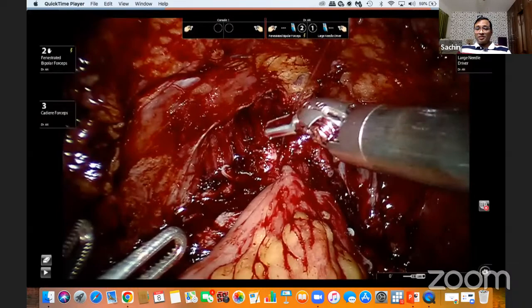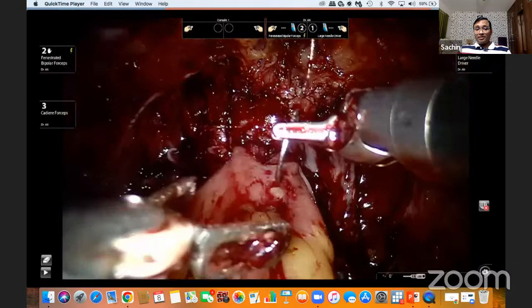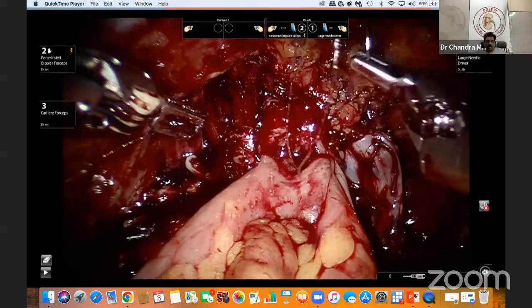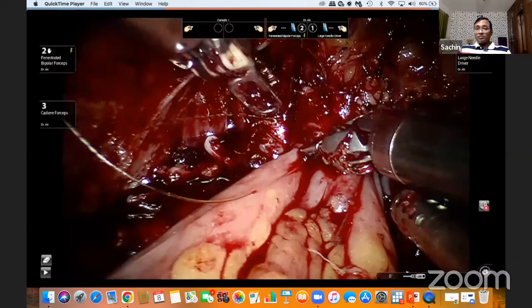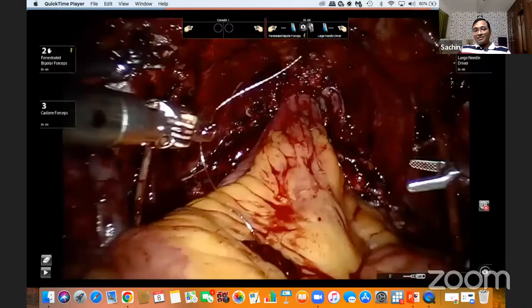This is the difficult part of the new bladder, to bring the intestine to the urethra. There are many techniques described. If it doesn't come down, we can decrease the pneumoperitoneum, we can decrease the Trendelenburg, we can put loops between the mesentery and pull the intestine, or we can make cuts in the peritoneum. Even with 40 centimeters, it won't come easily because of thick mesentery. You can make an incision over the peritoneum of the mesentery also. So many techniques are there to bring it down. In this patient, it went in easily.